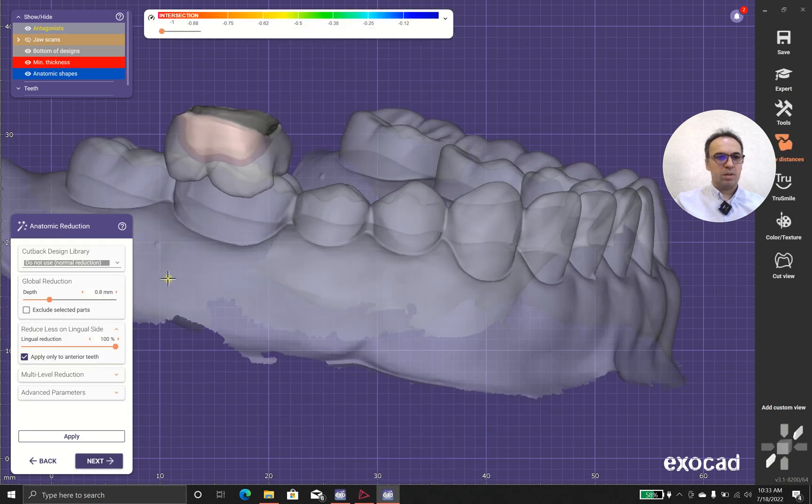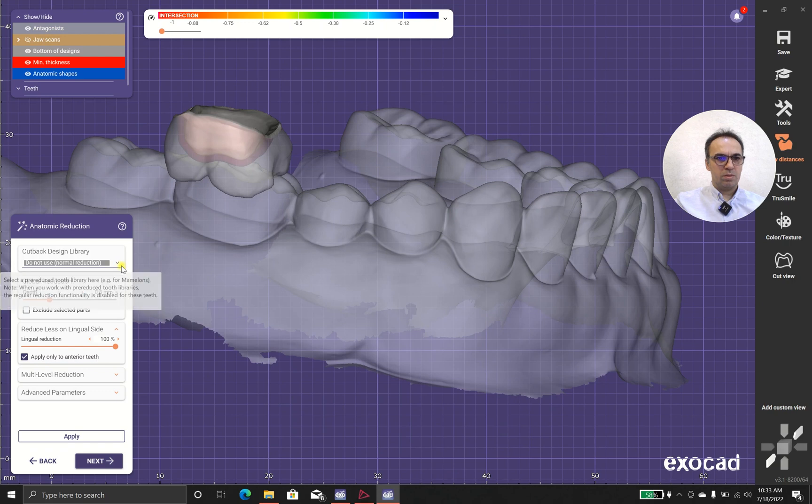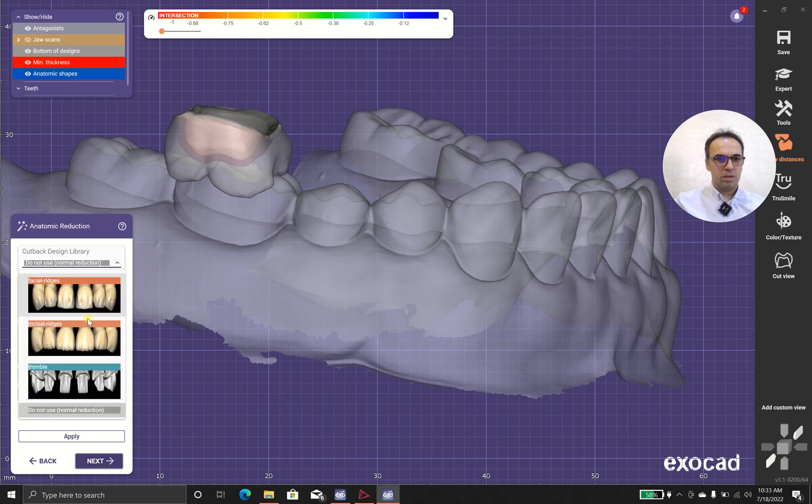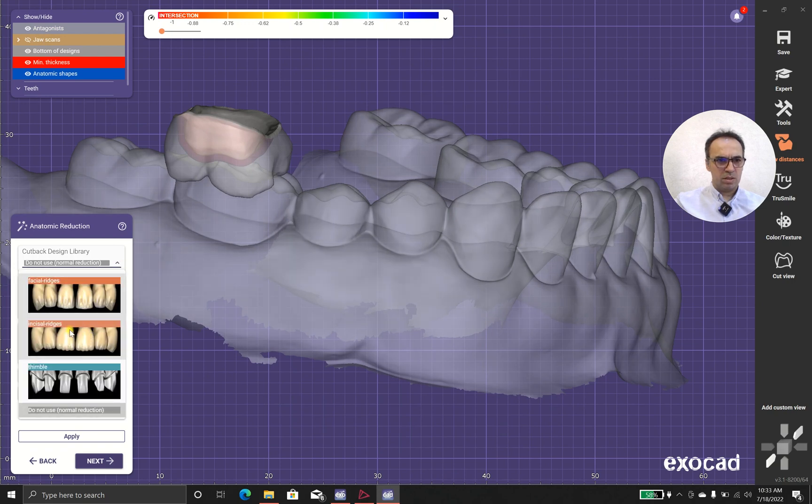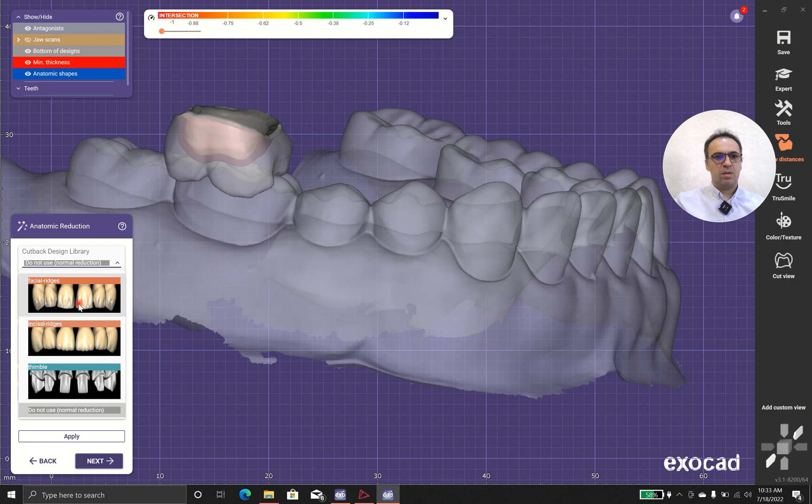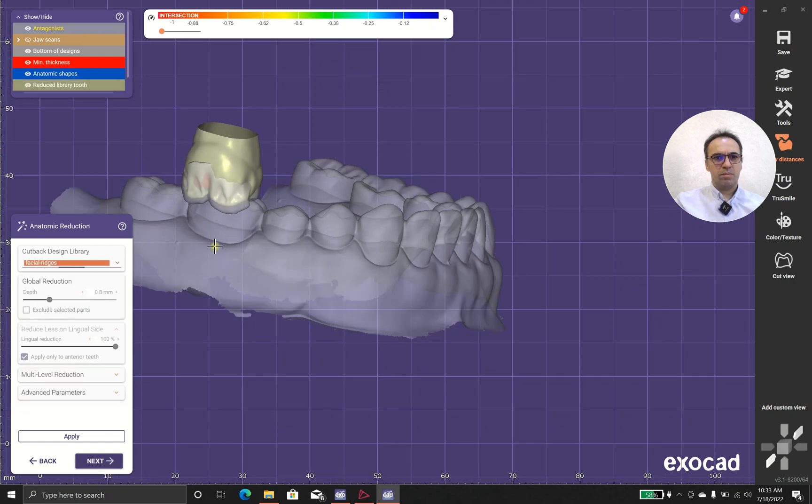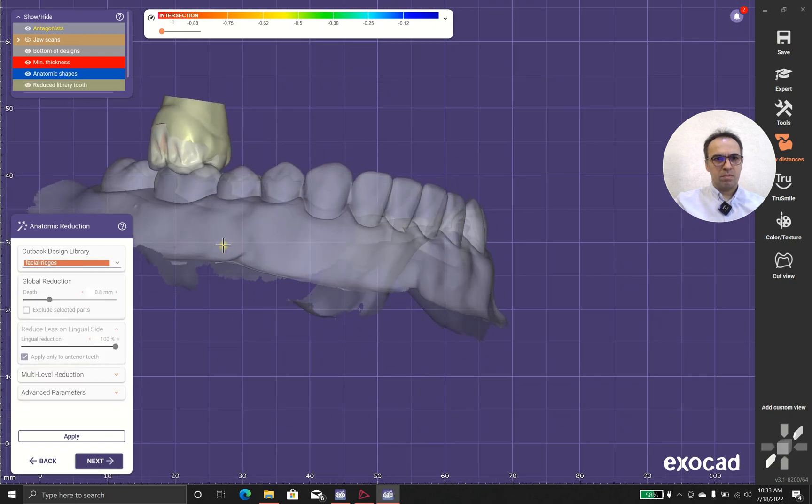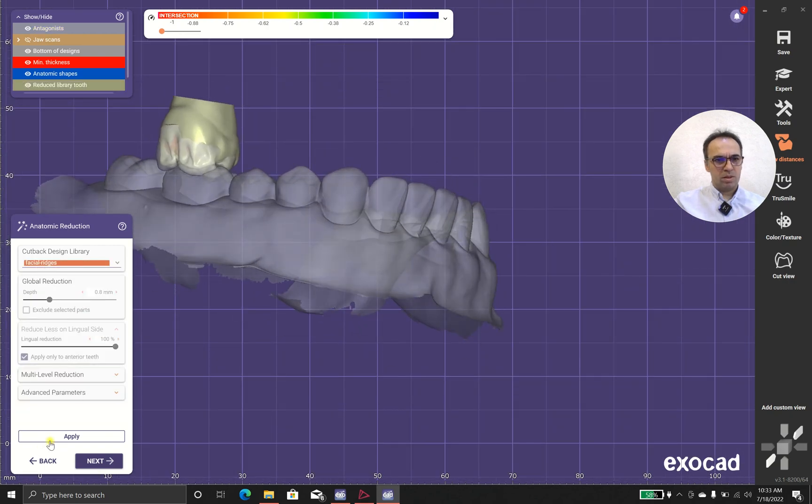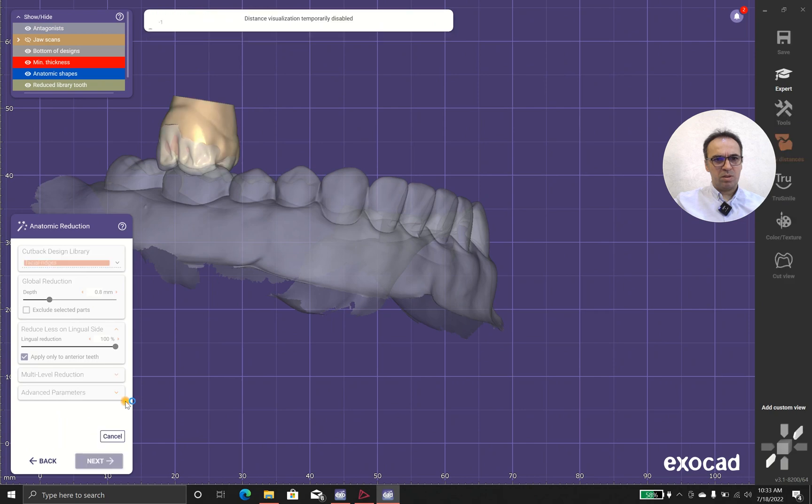Now we are going to reduction. The reduction in my eyes doesn't changed, but sometime in reduction we have problem.